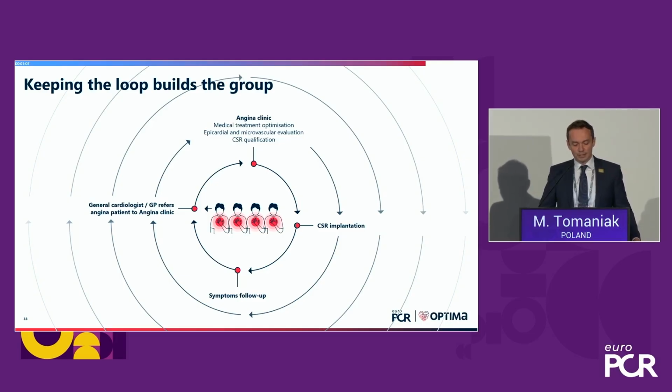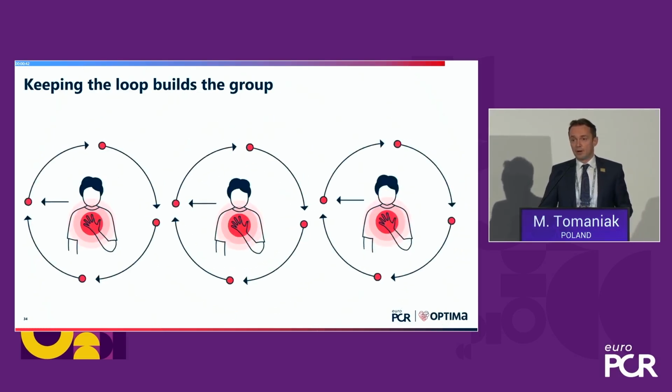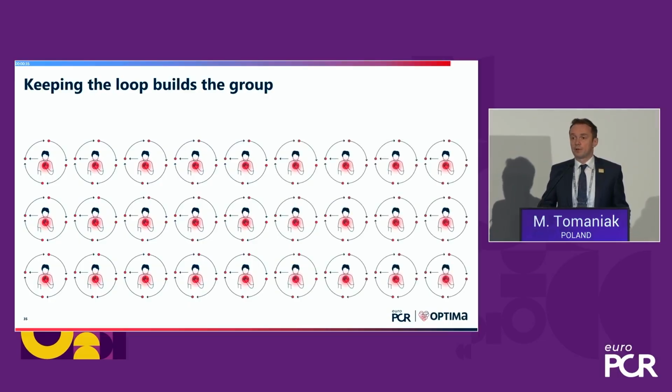I say to my team that keeping the loop actually builds your group of patients that you can treat with this therapy. And in my experience, that really encourages these general cardiologists to refer to this therapy. They are aware of the outcome, the safety, and the potential angina relief, and they refer even more patients themselves or their colleagues, whom they speak with each other. So this good news is spreading by word of mouth.